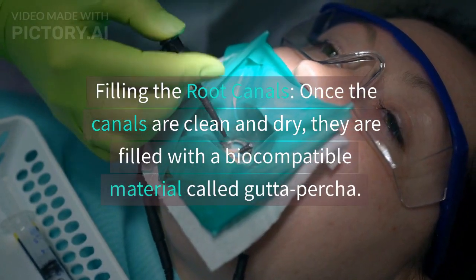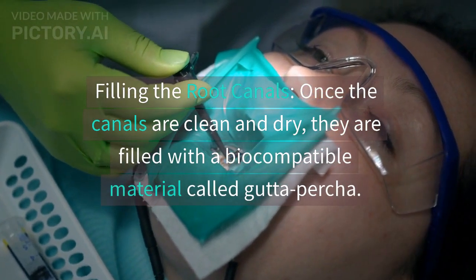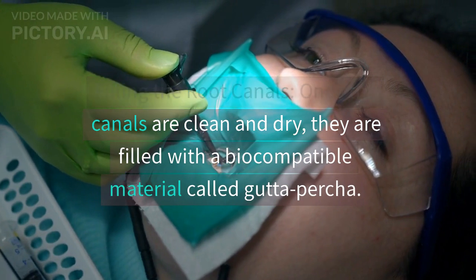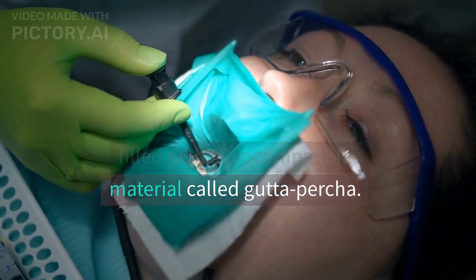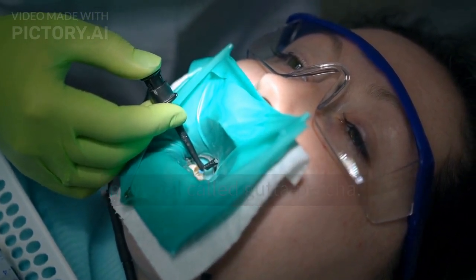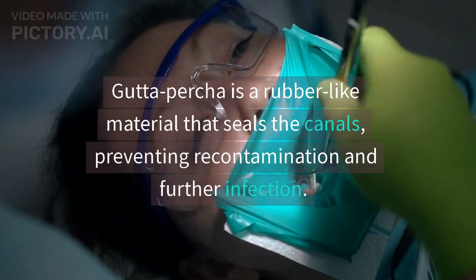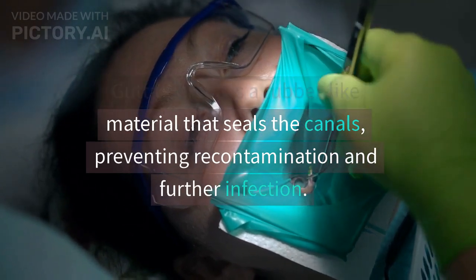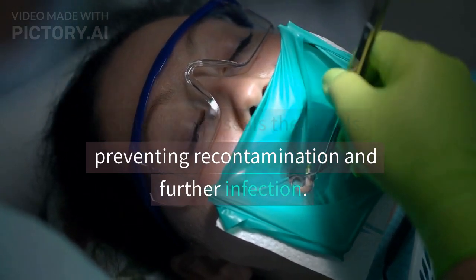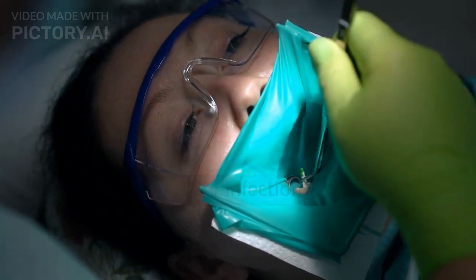Filling the root canals. Once the canals are clean and dry, they are filled with a biocompatible material called gutta percha. Gutta percha is a rubber-like material that seals the canals, preventing recontamination and further infection.